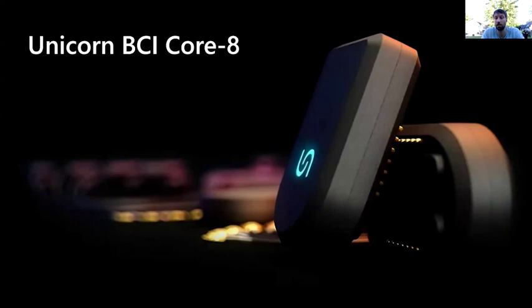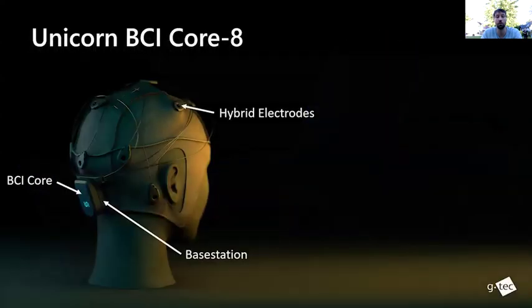The device that we use for the measurements is the Unicorn BCI Core-8, as you can see in this slide, and you may have already seen it in other presentations at the spring school. Actually, we already did a measurement with Santi at the hyperscanning today in the morning, so maybe you've seen it. For humans, the device looks like so. We have this very small wireless device that can be used with a standard cap and our hybrid electrodes. The device offers a base station and the BCI Core, the amplifier, that is just plugged on top with magnets, and with that you can start recording.